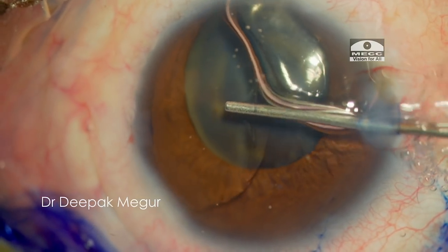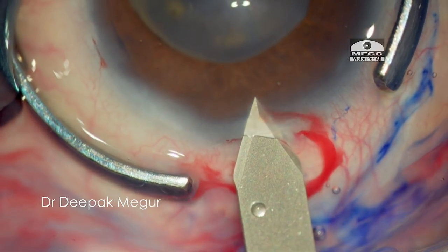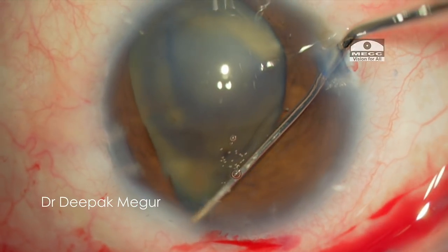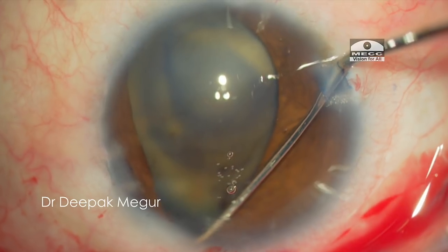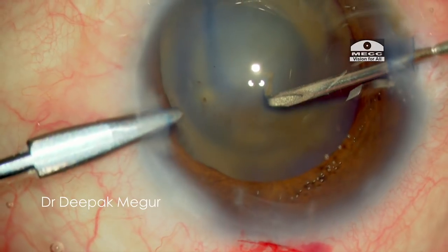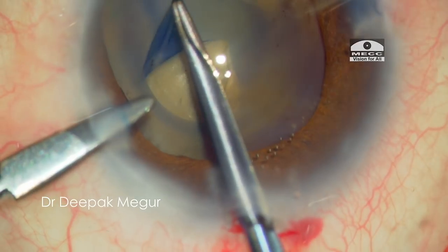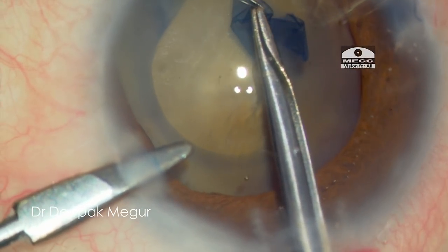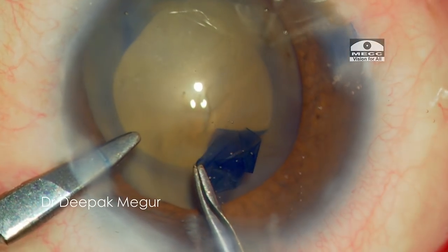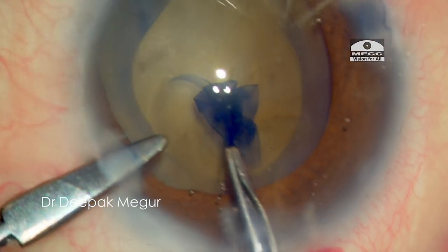I am using a soft shell technique for protecting the corneal endothelium, and this is my 2.2 mm posterior limbal incision. I am stretching the pupil using a Y-hook for better pupillary expansion. I am aware that my rhexis needs to be sufficiently large so that nucleus management becomes a little less complicated, as I am dealing with a large nucleus. I feel this rhexis is around 5 mm and looks to be alright.